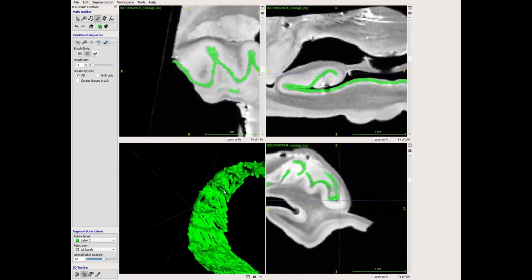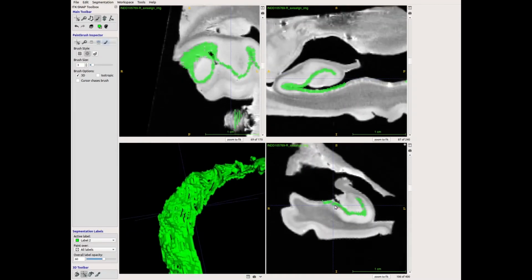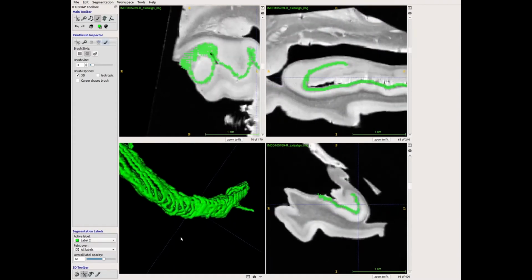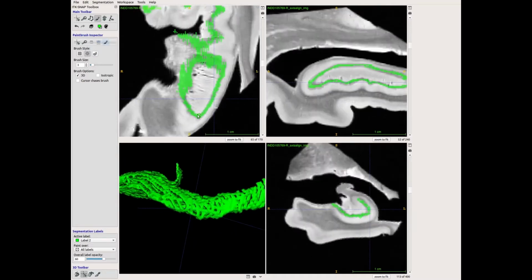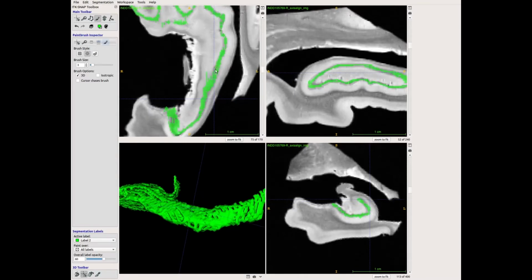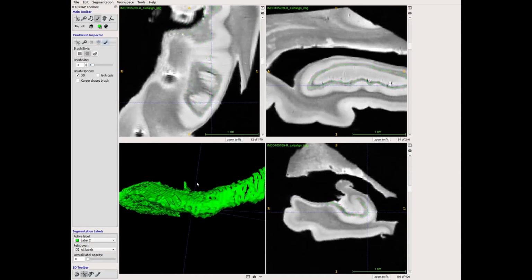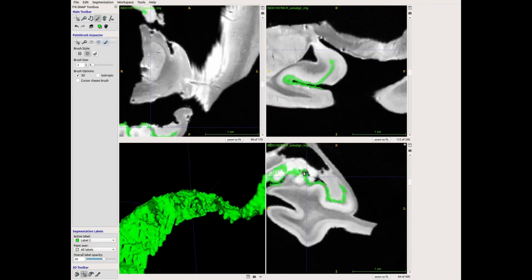You can see also, so this is the tail of the hippocampus, so the posterior of the hippocampus. You can see a few clear little digitations, or bumps really, in this label. So this is something we will often not see in 3D MRI, I should say in vivo MRI. You really need a high level of detail to see this. So you'll see it sometimes in histological samples, depending on the direction that it's been sliced in, or with ex-vivo scans like this one.